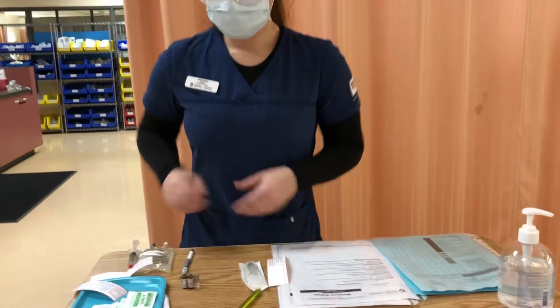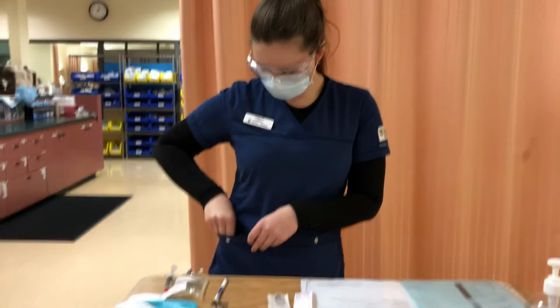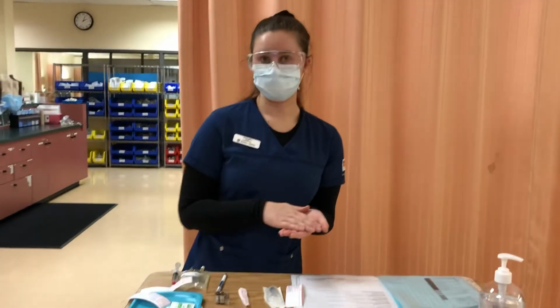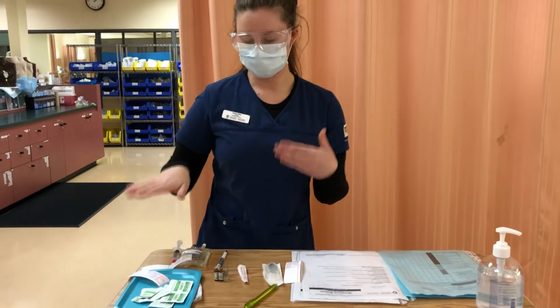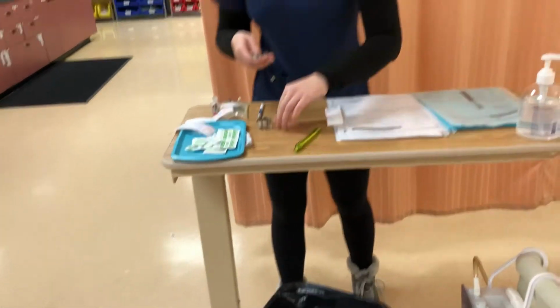So in clinical practice, I would be using a blunt fill filter to pull up from an ampule, but they are very difficult to use in the demo setting when they are reused. So I will just be using a normal blunt fill, and I would also be taking the blunt fill filter and switching it out with a regular one before injecting into the mini bag, but for demo practice, I will just be using the one blunt fill.